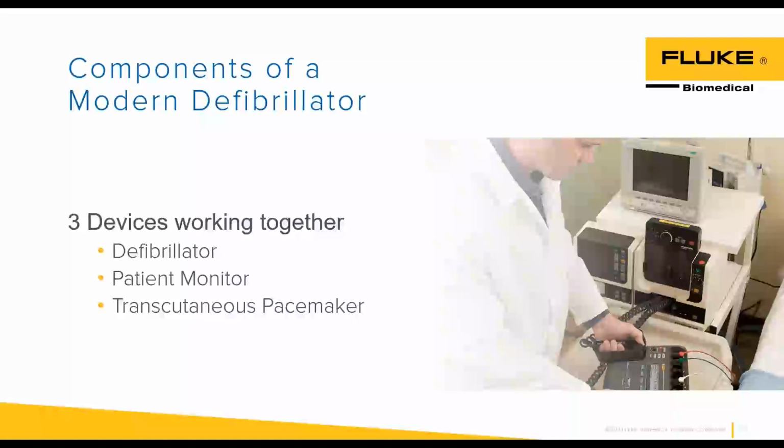So when we're talking about a monitor defibrillator, you're actually not just having one device. You could have three devices all built into that box. And that's something really important to remember, because as you're testing it, you're going to have to test all three of those sections. There's other things that might be built into it that we didn't even talk about yet, like a transthoracic impedance monitor. We'll talk a little bit more about that in a minute.